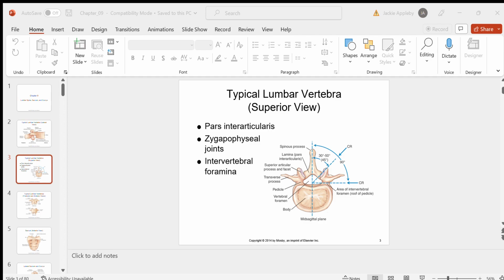And posterior or anterior oblique? They're laying on their belly, face down. No, anterior. They're laying on their belly, right? So it's an anterior oblique and it's a right anterior oblique. So you have to roll this patient this way onto their right shoulder, so their right shoulder's down.